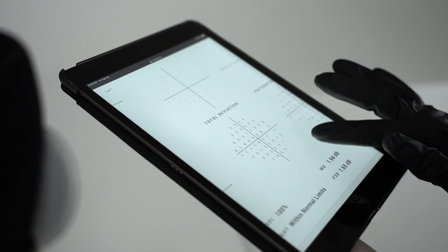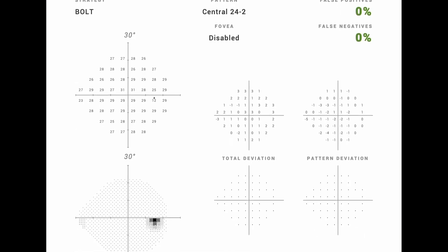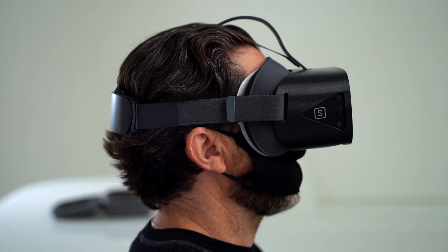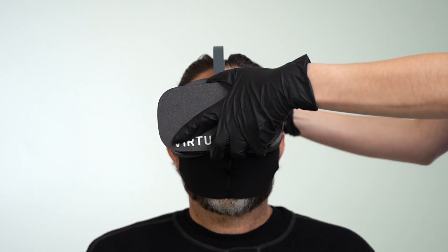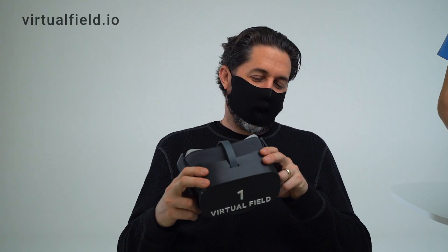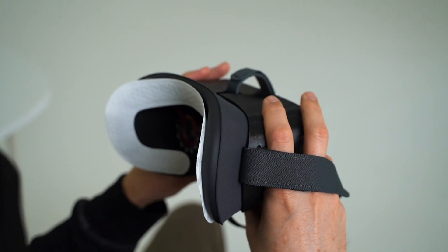If an error rate rises, a short audio prompt is played in the patient's native language to correct them. When the test is complete, the results are immediately available to your entire team wherever they might be. Results can be exported as a PDF, JPEG, or DICOM file and uploaded to any EMR system. For details about clinical validation, check our website, where you can find links to posters from Bascom Palmer, University of Texas, and more.